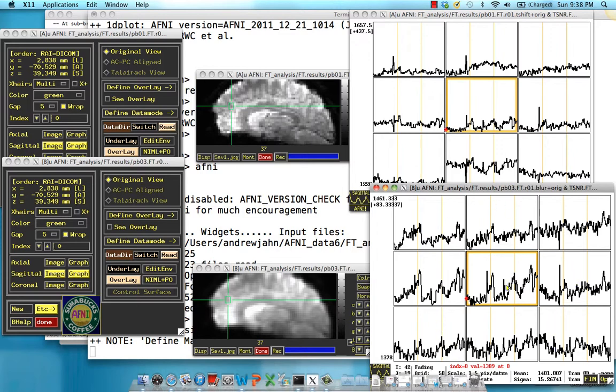You'll also notice that this signal time course is slightly less noisy than it is up here. The idea behind spatial smoothing is that if we take an average of surrounding voxels, any actual signal should be amplified and any noise should be averaged out. That's the whole idea behind smoothing.